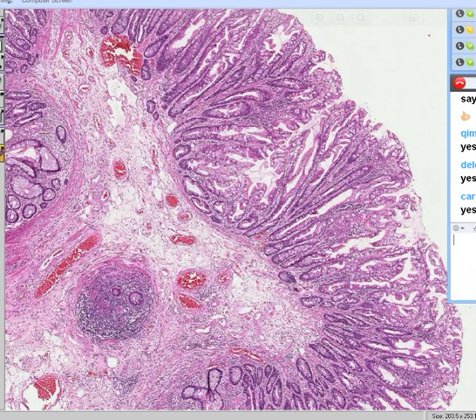Well, let me ask you this. When you look at the mucosal cells here that are thickened, do you say it looks like one type of clonal cell, or do you see a mixture of goblet cells and absorptive looking cells? In other words, is there a mixture or are they all the same?